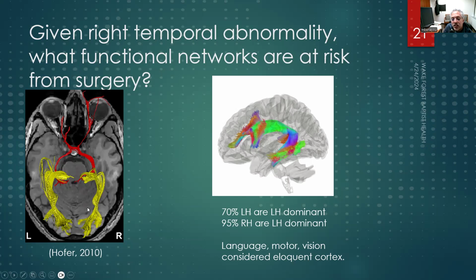And so we do have ways clinically to image the white matter tracts because, for example, in the language situation, if you spare Broca's and you spare Wernicke's and you sever the arcuate fasciculus, clinically the patient wakes up mute all the same. So for surgical planning purposes, you'd like to know both where language resides in terms of Broca's and Wernicke's, but you'd also like to have a clear anatomic delineation of the axonal connections so that you can plan for surgery with both those pieces in mind. So this is a different methodology, and I'm not going to talk about the math of this, but just wanted you to know it's an adjunct and it's relevant for the whole process of surgical planning.